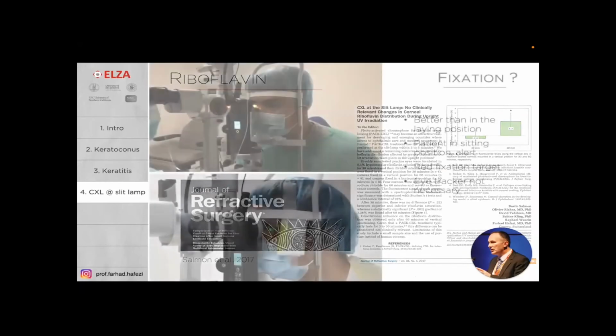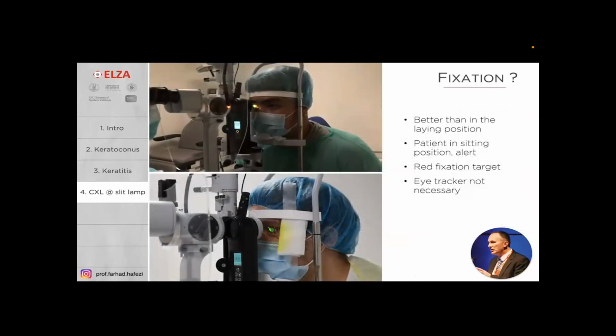Another question is, what about fixation at the slit lamp? Well, my answer is, let's look at these videos. The lower video is running. The only reason you see it running is the flickering of the screen. The patient is totally stable.